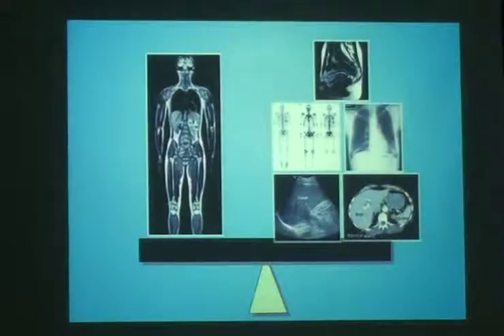Now, if we are comparing whole body MRI, we could compare it to a multitude of imaging tools, while in a single setting the patient will gain all the information needed regarding bone, soft tissue, and nodal lesions and properties.